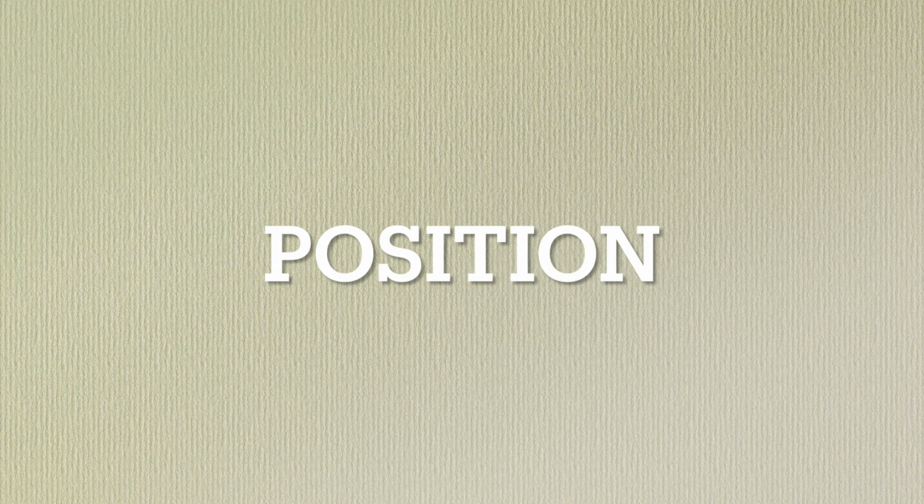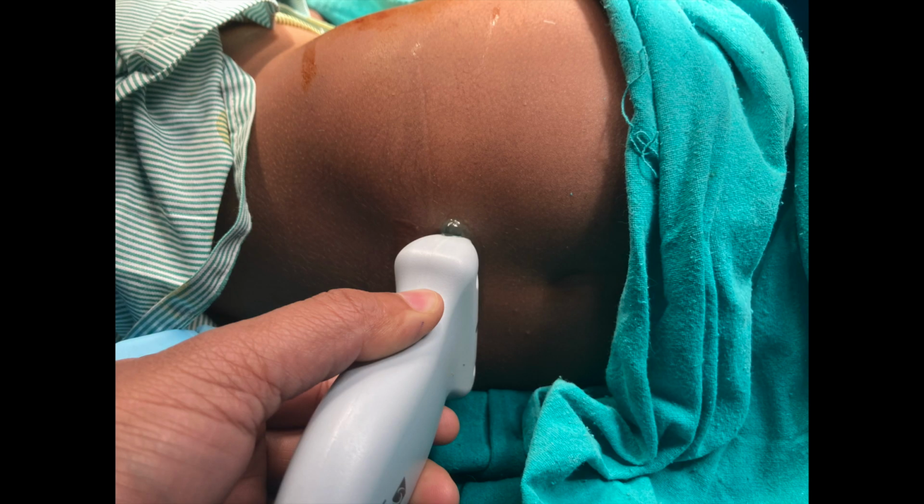Patient position. The patient should be placed in a lateral position, and the legs of the patient should be flexed over the abdomen.